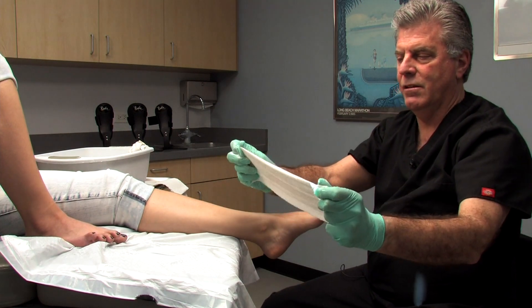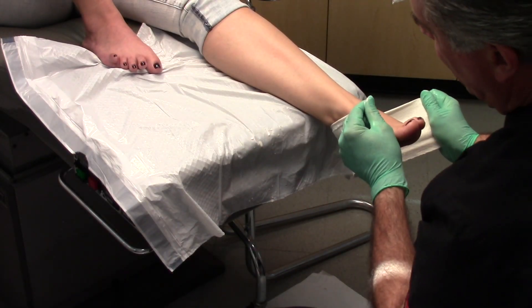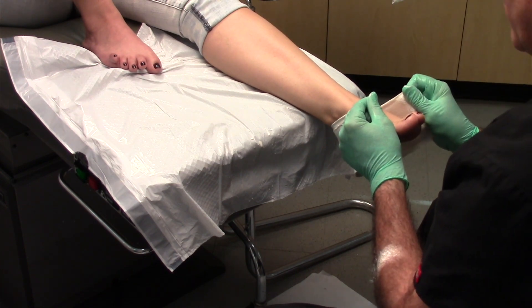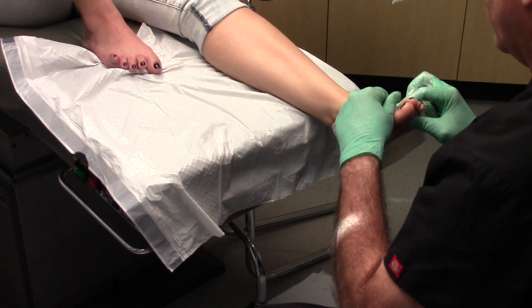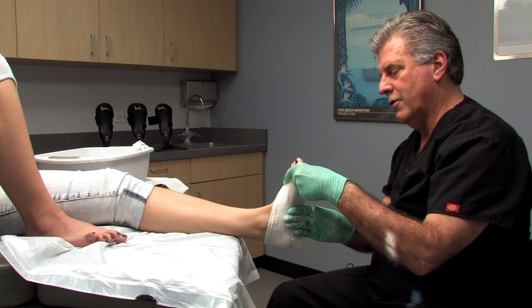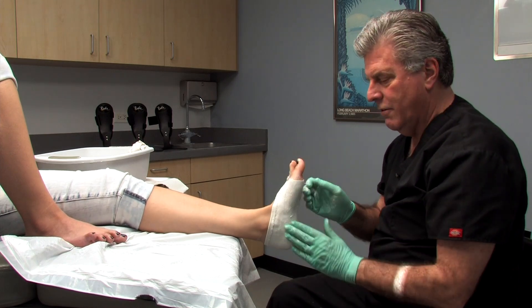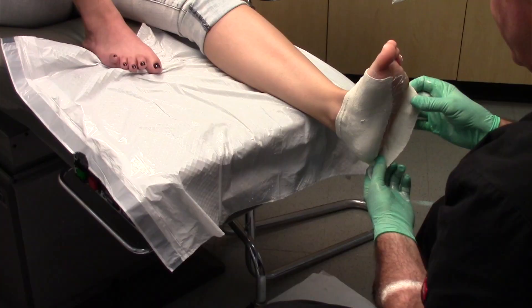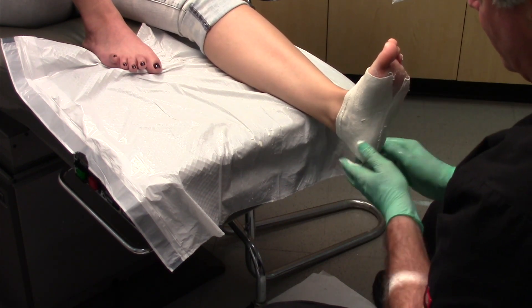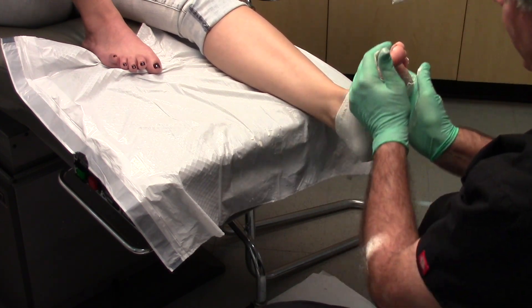Fold a slight hem at the top of the first strip. The placement is as close to the malleolus as you can get it, medially and laterally — just below the malleolus and just over the top of the foot. Have the patient hold their foot dorsiflexed and mold the plaster first medially into the arch, then laterally, making sure there's a clean overlap with no bunching or wrinkling, including the heel.